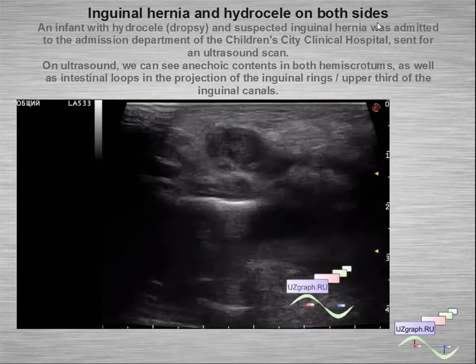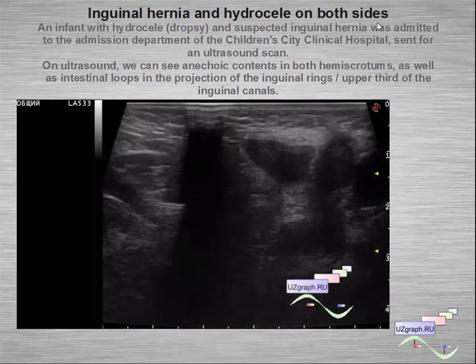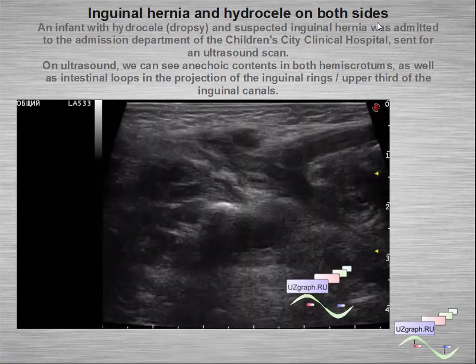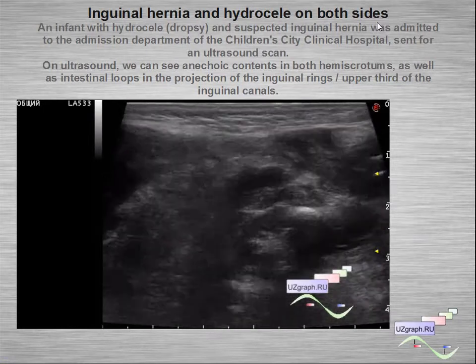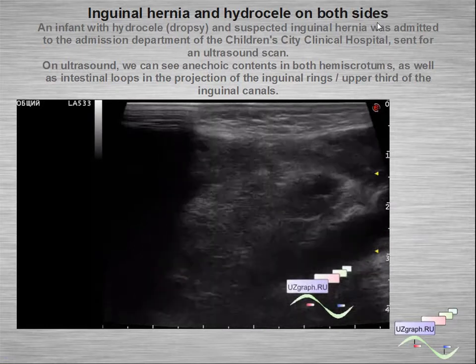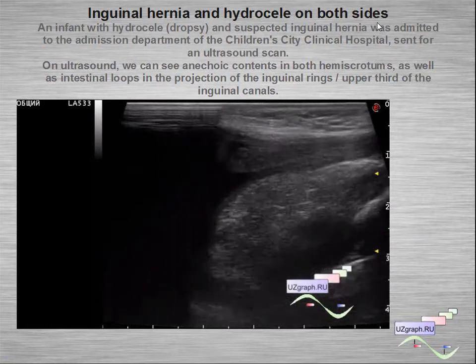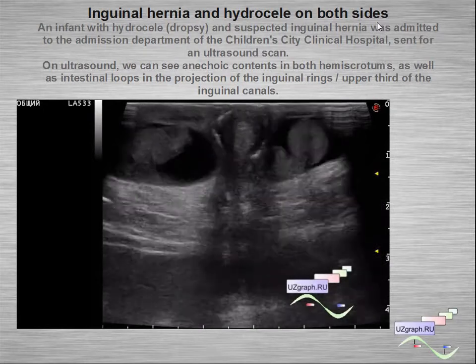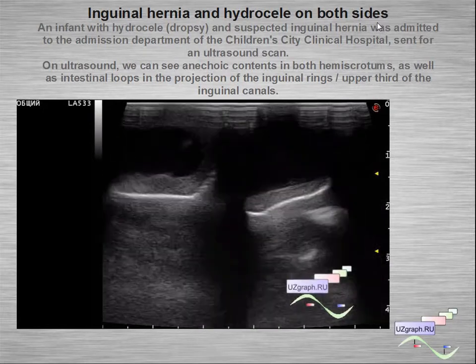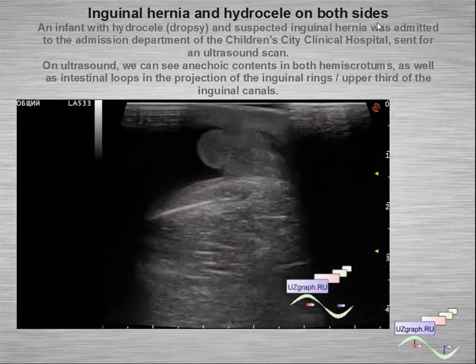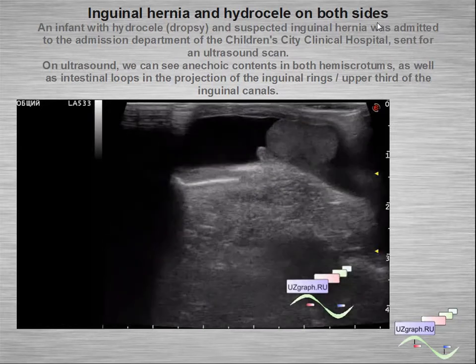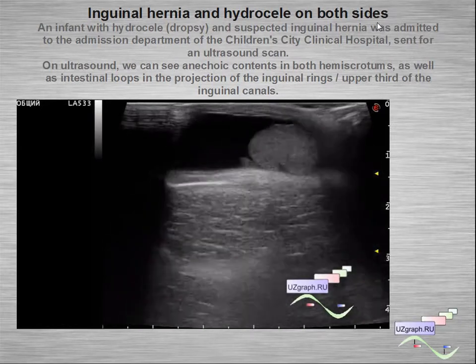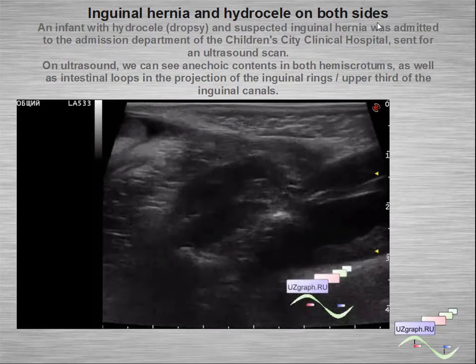In another case of inguinal hernia with hydrocele on both sides: an infant with hydrocele and suspected inguinal hernia was sent for ultrasound. We can see anechoic content in both hemiscrotums as well as intestinal loops inside the inguinal rings or upper third of the inguinal canal.